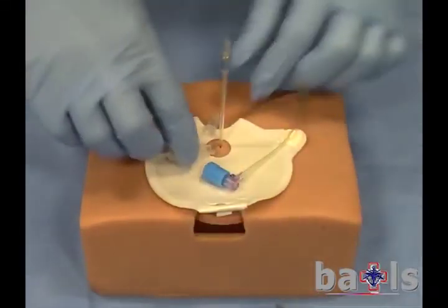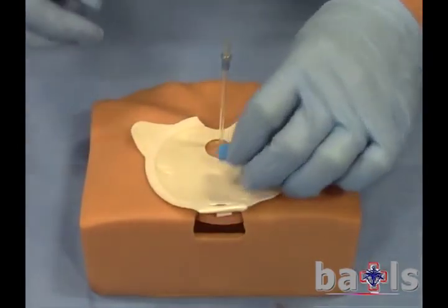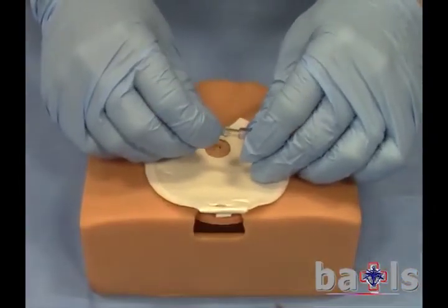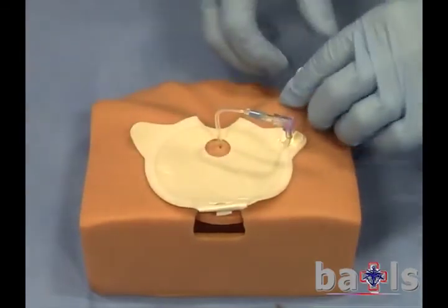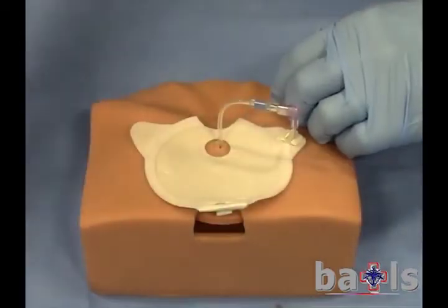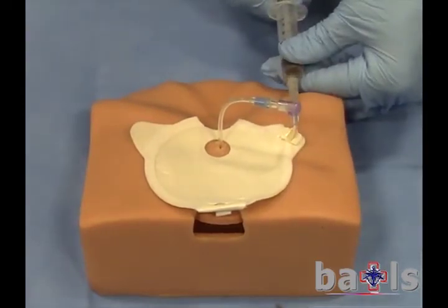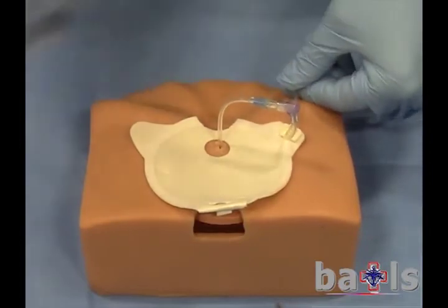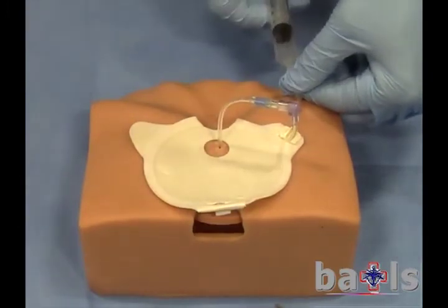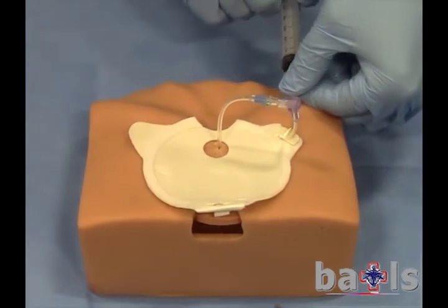Dispose of the fired device as hazardous sharps. Connect the cannula to the tubing attached to the target pad. Using a 5ml syringe, aspirate to confirm location. With a fresh 5ml syringe of saline, forcefully flush to cavitate the sternum.